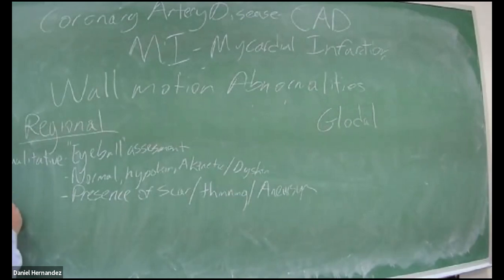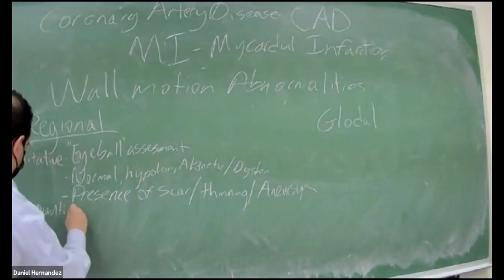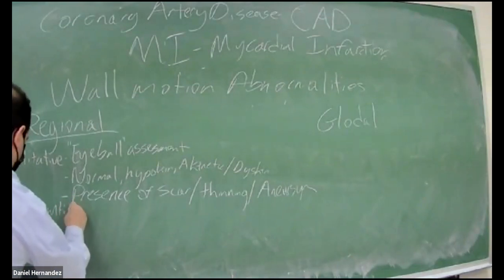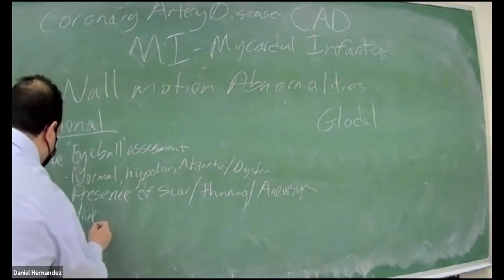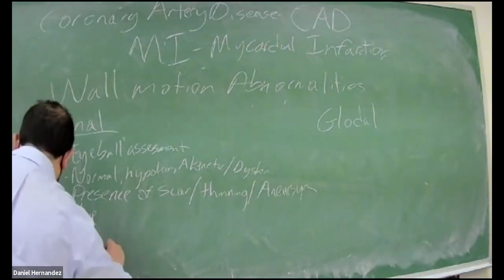Then we can do a semi-quantitative assessment, and that is our wall motion score index.